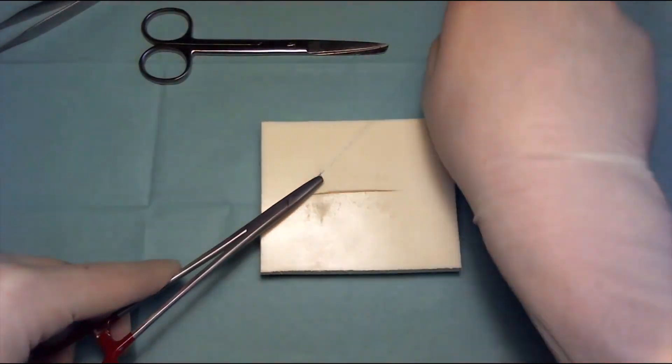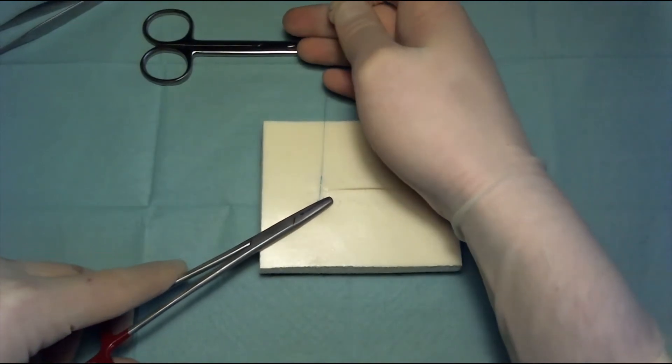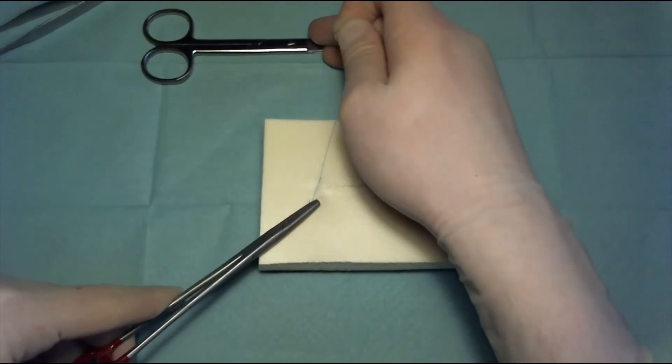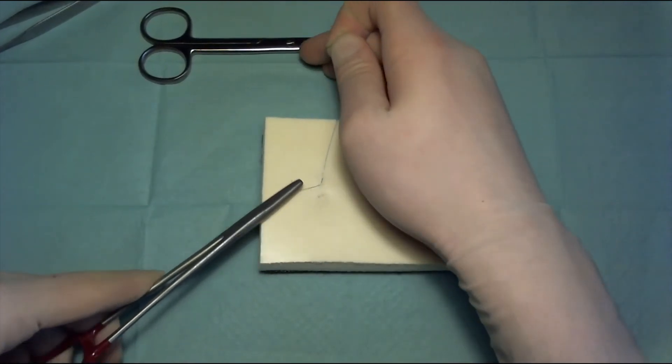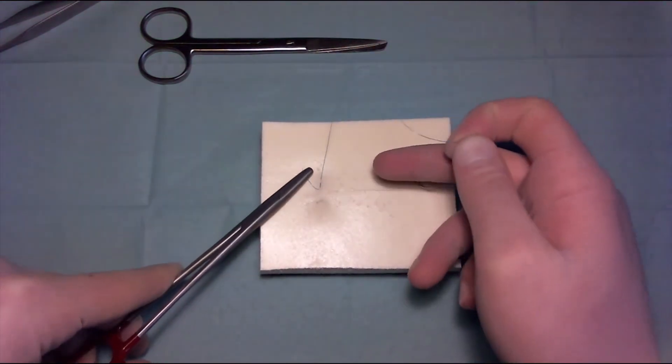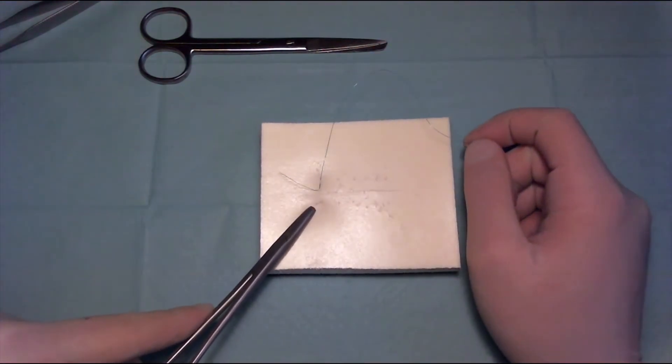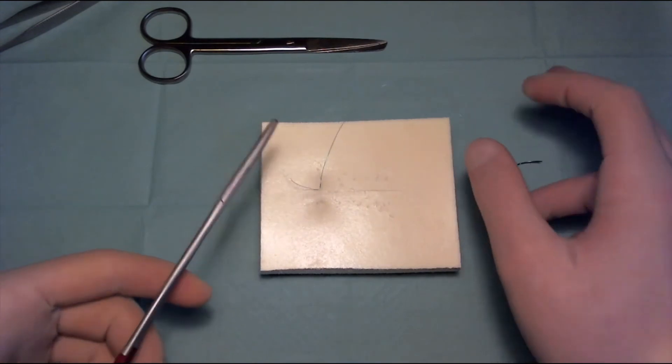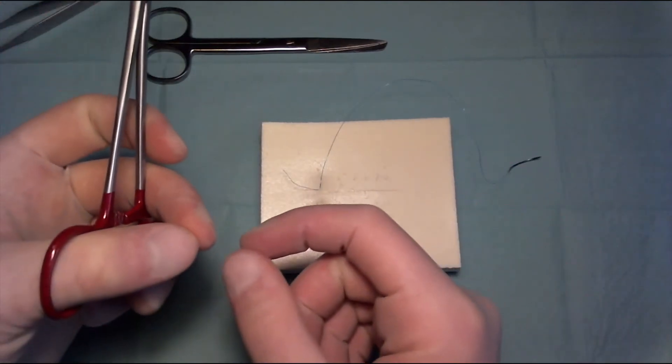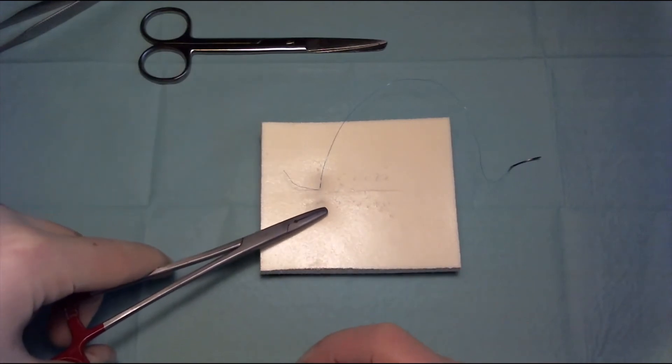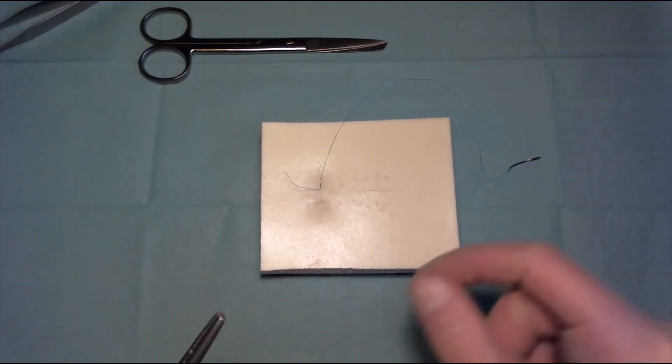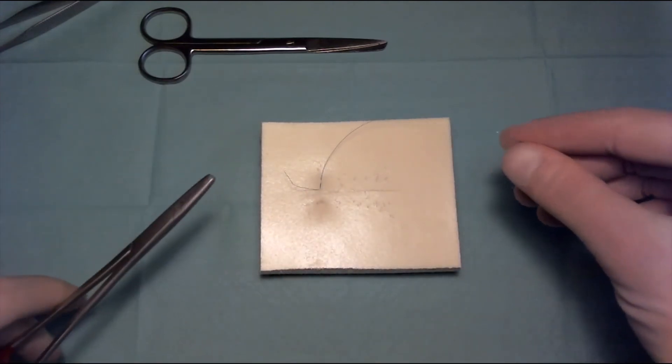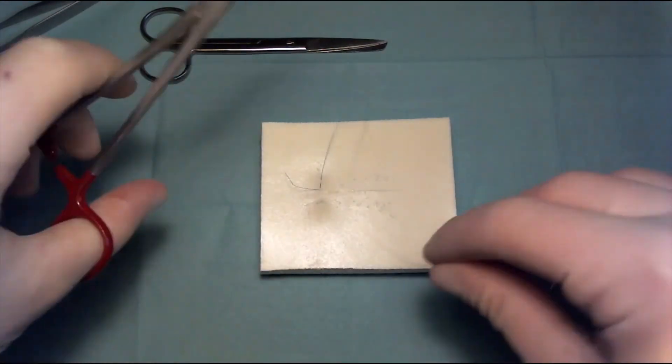Grasp the short end, switch sides so that we get a flat knot. Now you can really put tension in because the Donati suture really needs some tension. You really want the wound to be approximated and the tension to be on the suture and not on the wound edge. First we did two away from us, so now one towards us, switch sides and pull tight.